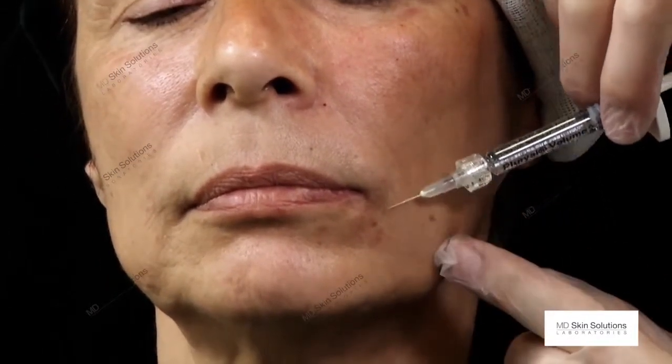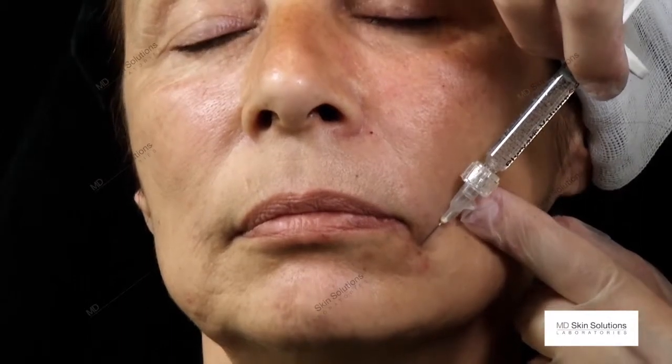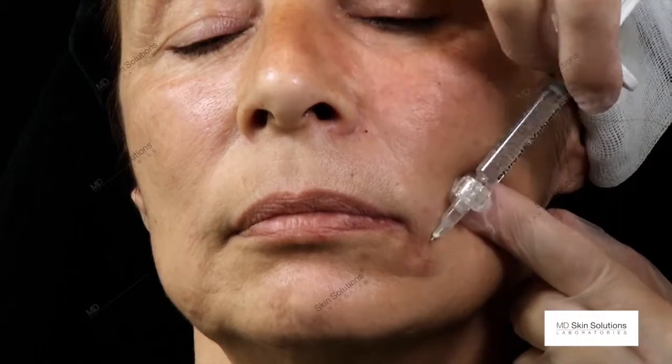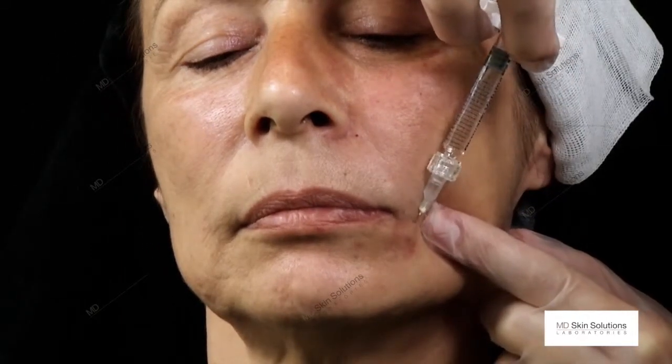The rest of the area to be filled is the prejowl sulcus. I go at the lowest, deepest point of this sulcus in a subdermal way, 45-degree, higher the needle, and then put in a fanning-wise shape the material.